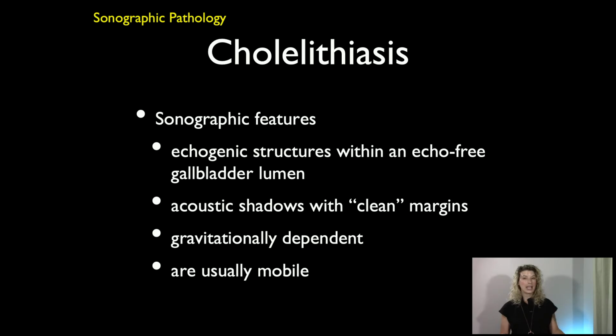Gallbladders are gravitationally dependent, so if you're not sure if you're looking at a stone versus some kind of polyp or something else, you can keep viewing the gallbladder and turn the patient, and the stones should move with the patient while the patient's turning, because they're mobile.